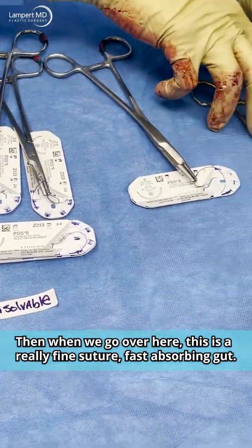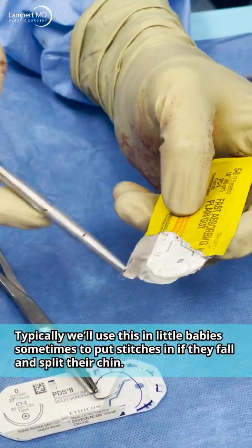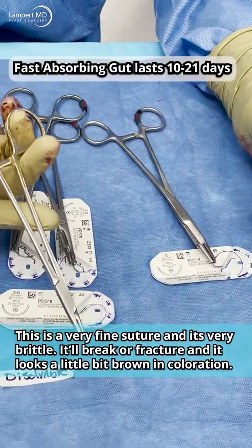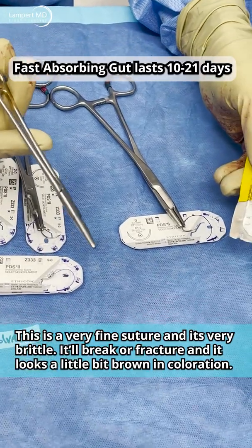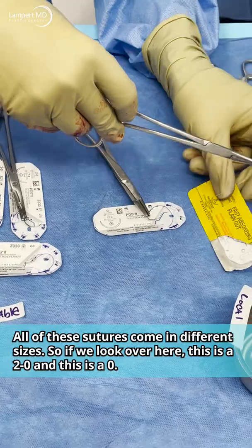This is a really fine suture — fast-absorbing gut. We typically use this in little babies, sometimes to put stitches in if they fall and split their chin. It's a very fine suture, very brittle — it'll break or fracture — and it looks a little brown in coloration.